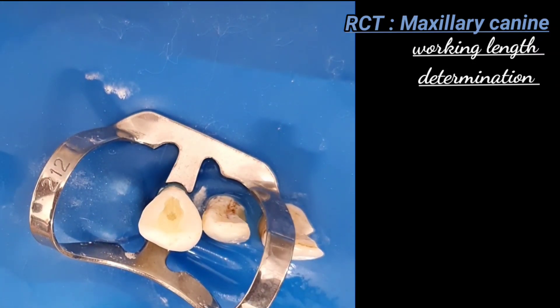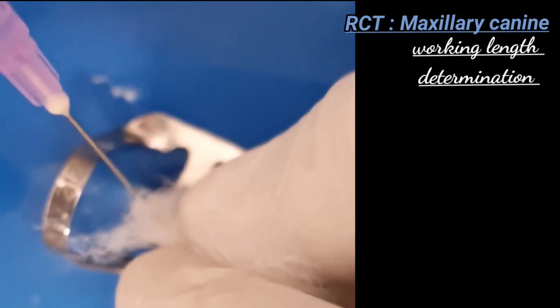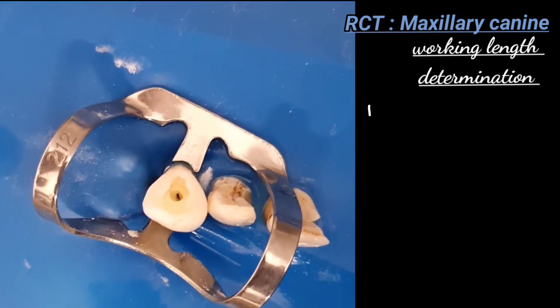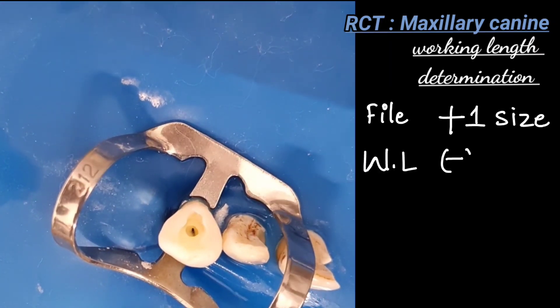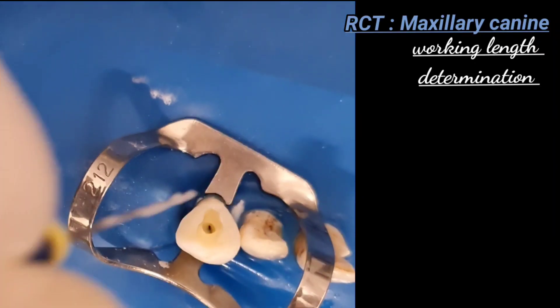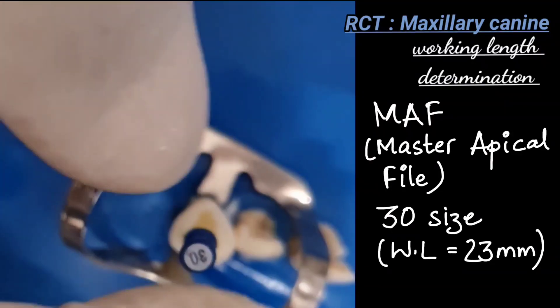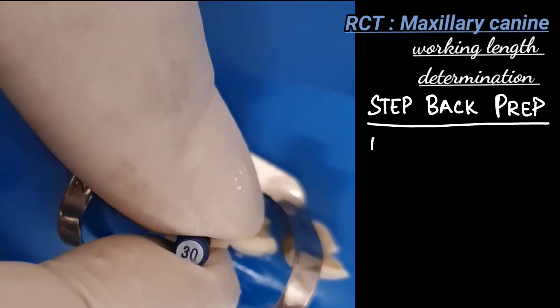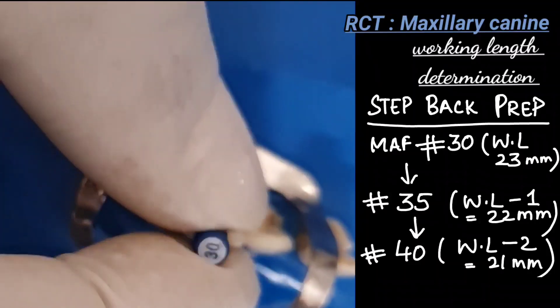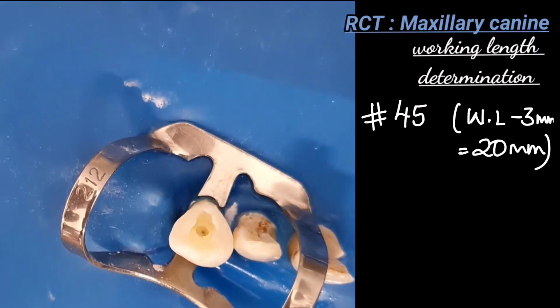Up to the number 25 file, we go to the full working length. After the number 25, we proceed with the step-back: we increase file size by one and decrease working length by one millimeter. So for the number 30 file — the master apical file — working length is 23 millimeters. For number 35, working length is one millimeter less; for number 40, it is minus 2 millimeters; for number 45, minus 3 millimeters; and so on to produce a coronal taper.